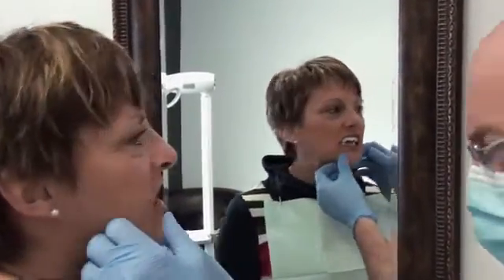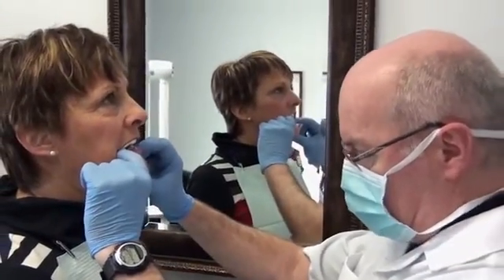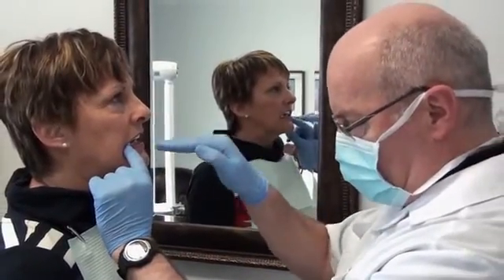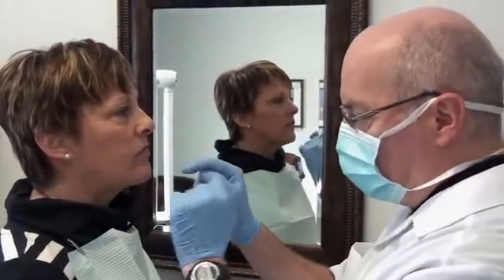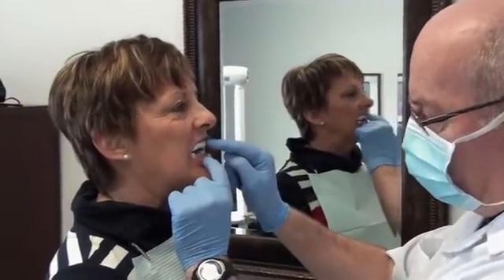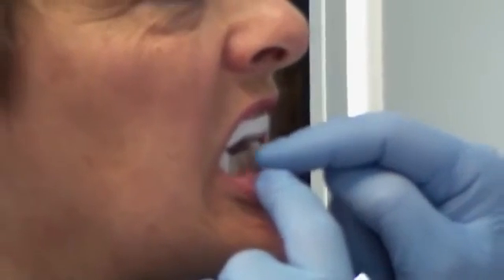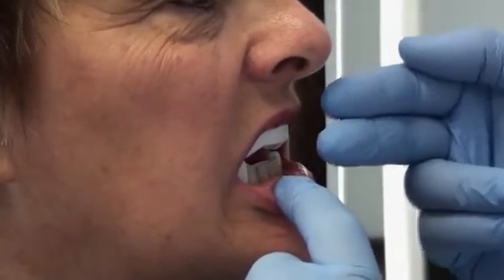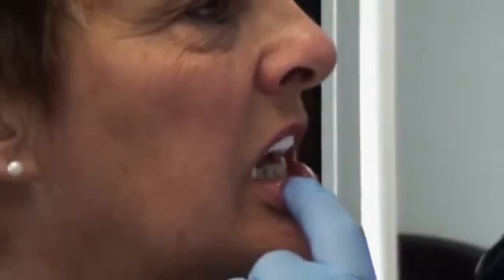We must make sure that the occlusion is even on each side. We may check with carbon paper and even up each side if needed. To the patient: do you feel that the right and the left sides make contact at the same time? Yes. Here we can see the advancement — teeth are almost end-to-end, or the lower teeth might protrude slightly, since the advancement is 70%. If the patient moves forward 3 mm, she will be in her maximum advancement position.